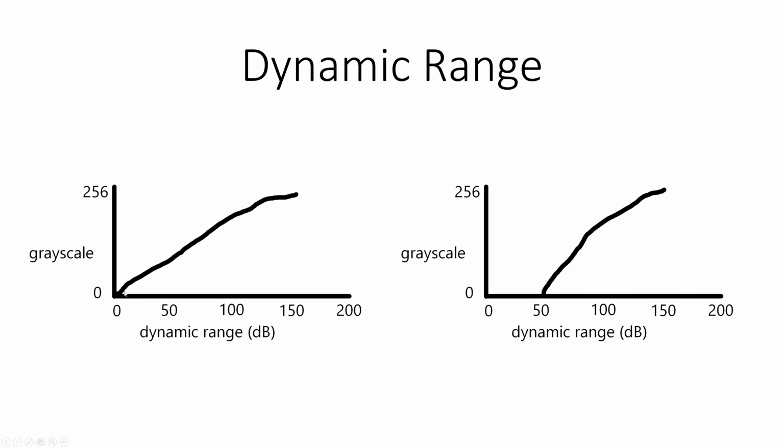But on this higher decibel dynamic range curve, those excluded anechoic echoes here are actually going to get assigned a shade of gray here. So the simplest way to put this all together is that the bigger number of decibels in your dynamic range, the more shades of gray you're going to get on the screen. So let's see what that looks like in reality.